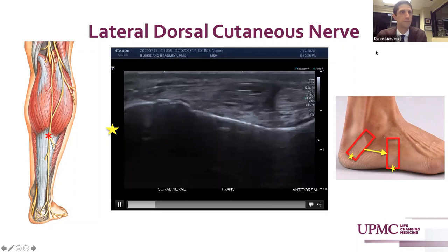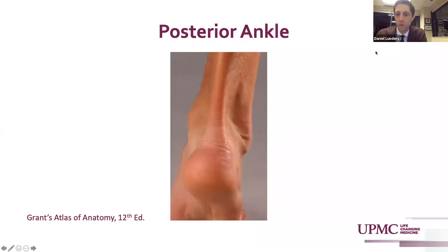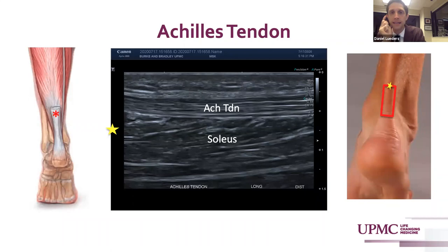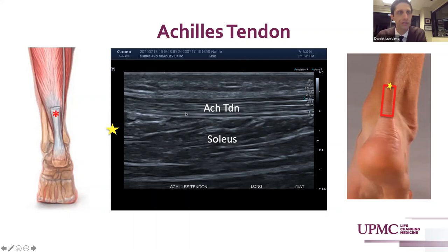Moving on then to the posterior ankle — there are fewer anatomic structures in the posterior ankle and these are more superficially distinct. The Achilles tendon, its retrocalcaneal bursa, the retroachilles bursa, and the plantaris tendon are the prominent structures. The Achilles tendon is the longest and thickest tendon in the body, up to 12 to 15 centimeters in length, comprised from contributions of the medial and lateral head gastrocnemius muscles superficially and soleus. Unlike most other tendons that have a tenosynovium, this Achilles tendon does not, but rather has what's called a peritenon, which contributes to pathology.